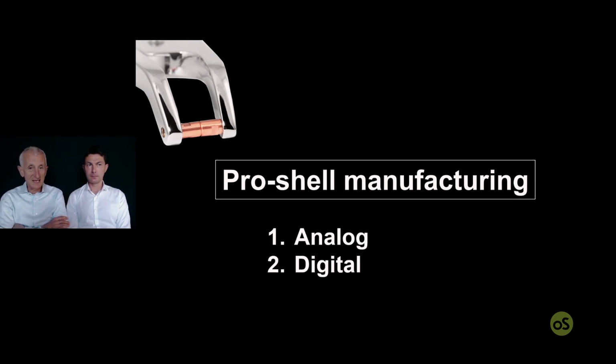Now in the next lesson, we will see how to make still a prosthetic shell, but with the digital approach. There are many kinds of material in blocks and disks and different kinds of digital approach. We will see and discuss this in the next lesson.